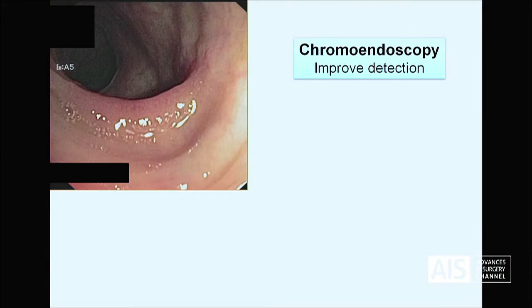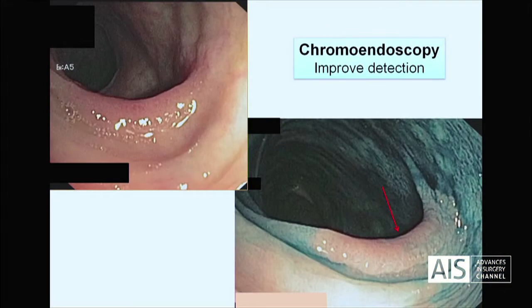Here we have another example. You can see in this haustrum that there is a little reddish area, and when we apply chromoendoscopy with indigo carmine we can see that there is a lateral spreading tumor — a polyp which in this case is benign. But if we didn't use chromoendoscopy, we probably would have missed this lesion and the patient could have had an interval cancer.